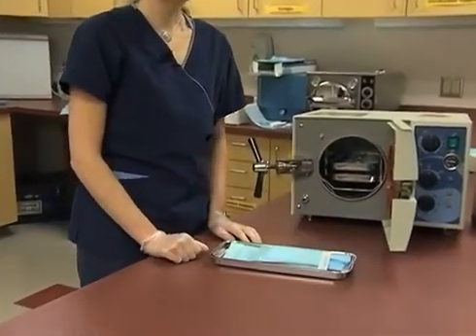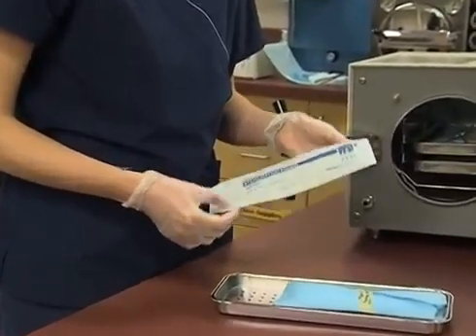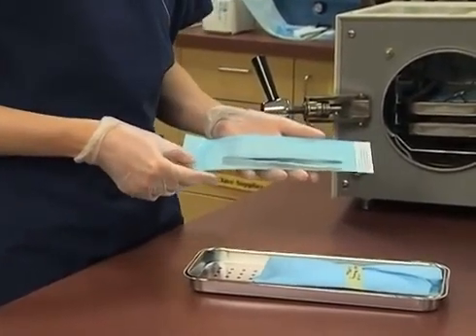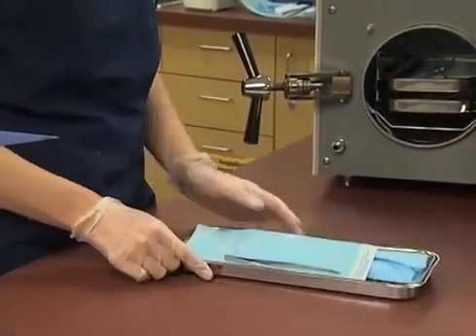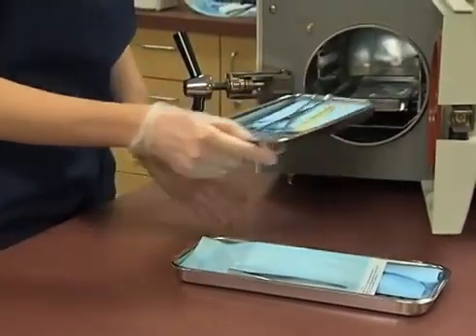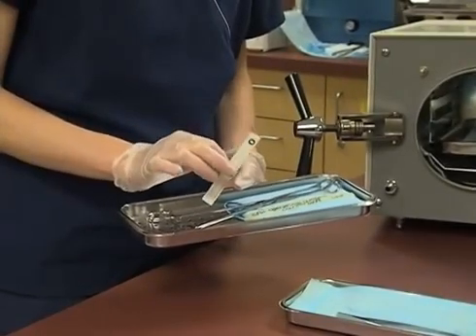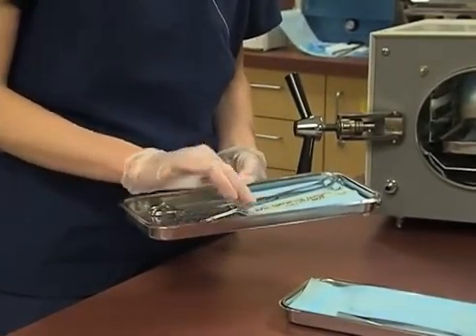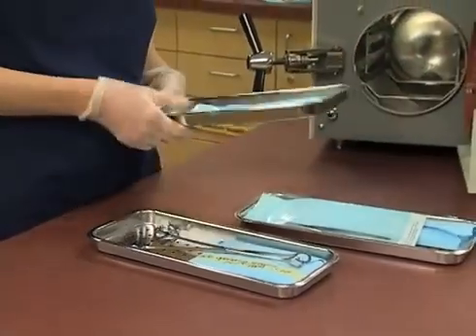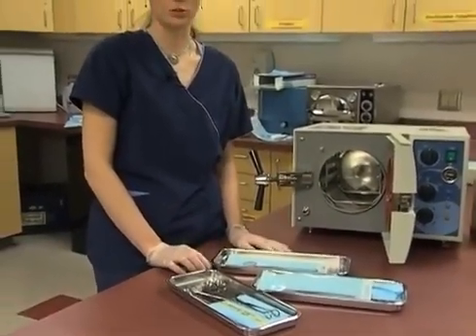The next thing we do before we put it away is we want to make sure that everything was done properly. So we'll be looking to see that the arrows had changed color and had been properly autoclaved before we put it away. Our tape will have changed color on our wrapped items. Our indicator will also have changed color to allow us to know that it's been fully sterilized. And then we know that all these items have been sterilized properly, and now we can put them away in the clean drawers where they're kept until they're used for a procedure.